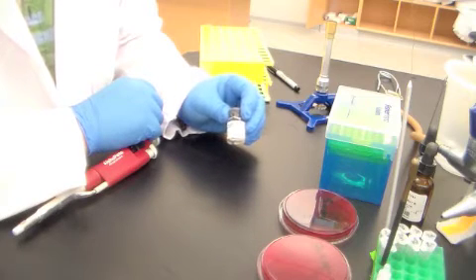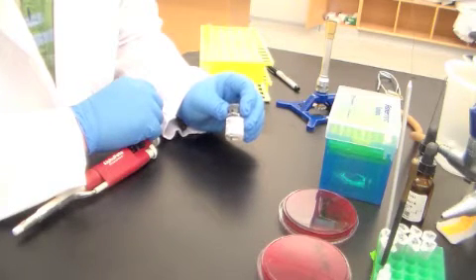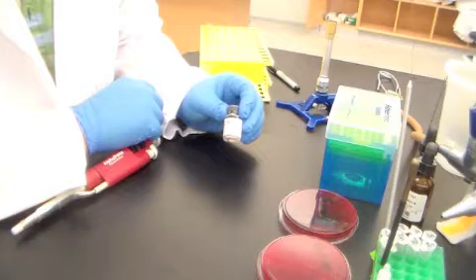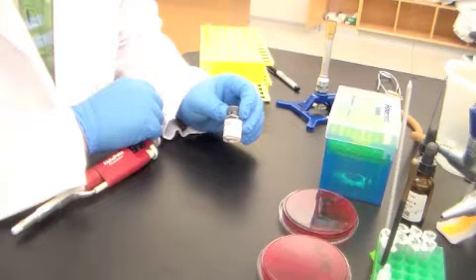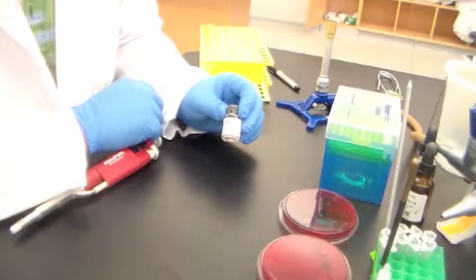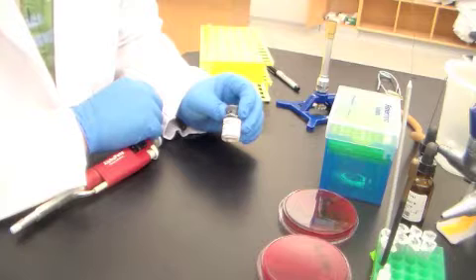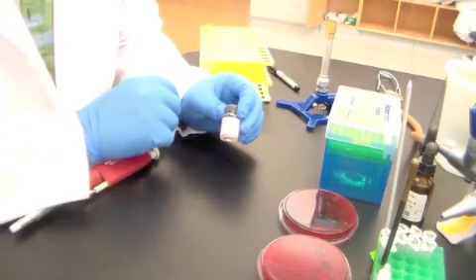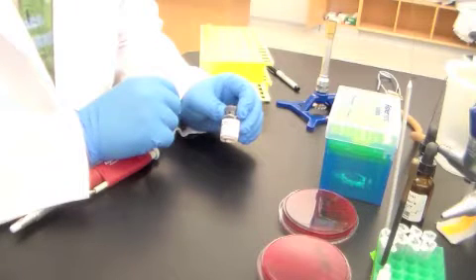If, however, blood is drawn with the idea of getting serum, which is frequently used for antibody tests, blood can be drawn without the use of an anticoagulant, in which case the blood forms a clot within the vessel that the blood is collected in. Then the cellular clot can be removed by centrifugation, and the fluid phase remaining is referred to as serum.